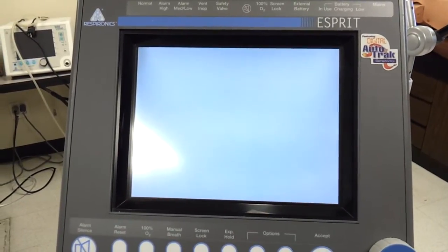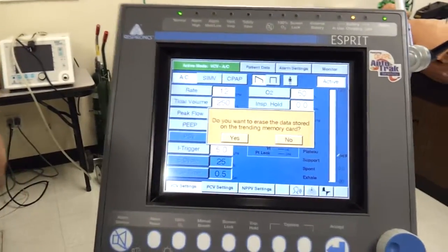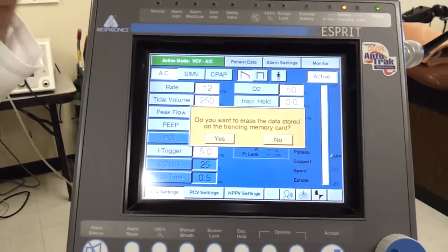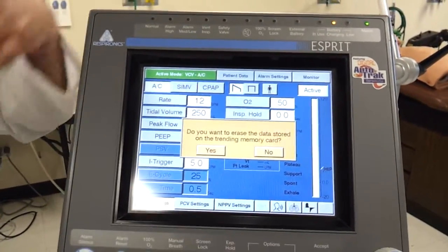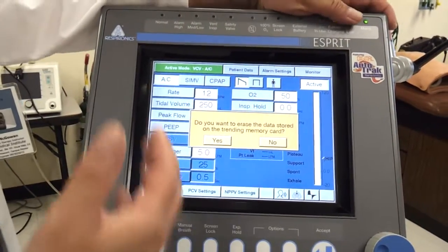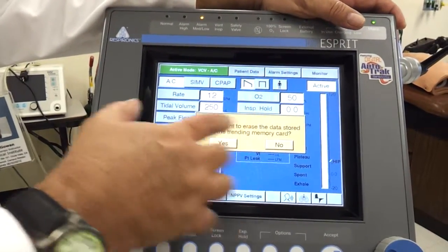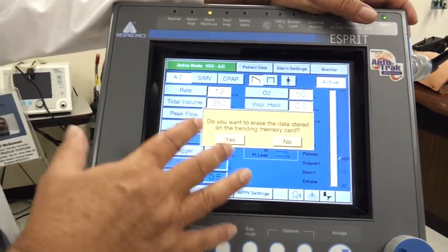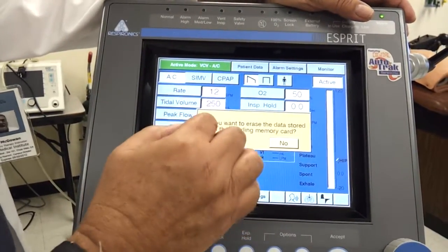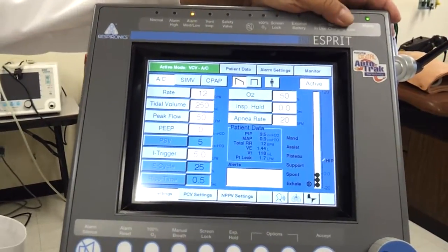Now it should pop up with a screen asking if I want to erase any of the trending information. It keeps a log of about 12 hours of everything it's done that you can download to a computer if you want to. If this is the same patient and I just disconnected him for some reason, I'll say yes, keep all that information. But if it's a new patient I'm putting on for the first time, I can erase all that old memory. So it says do you want to erase it — I'll say yes. So now we're starting over again.